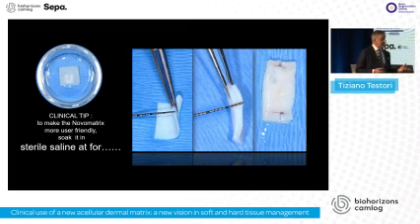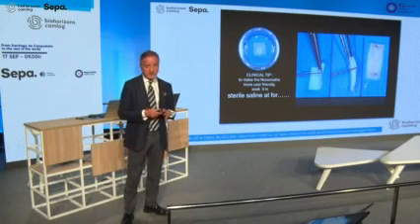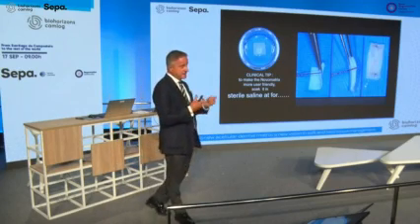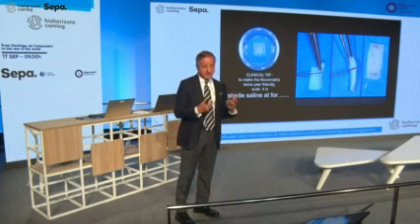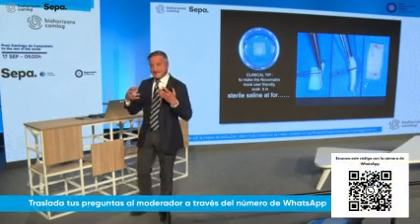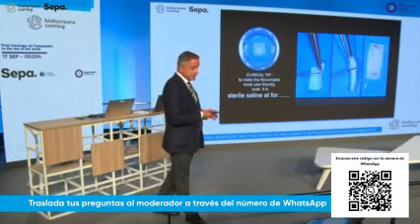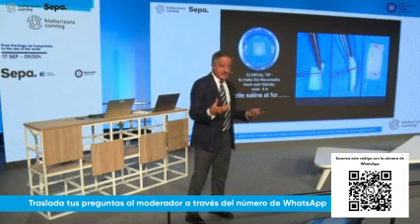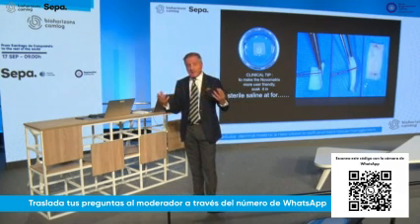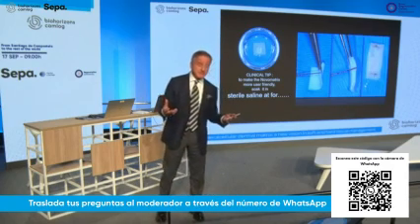The clinical tip for the Novomatrix, which I said is one of the most user-friendly membranes on the market because it's not very stiff, it has no memory, but if you want to make it similar to a collagen membrane, you got to soak it in saline for, we do in our offices and in our department, more than 5 minutes.